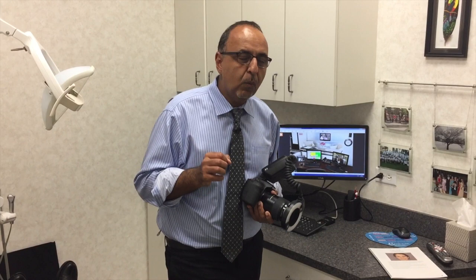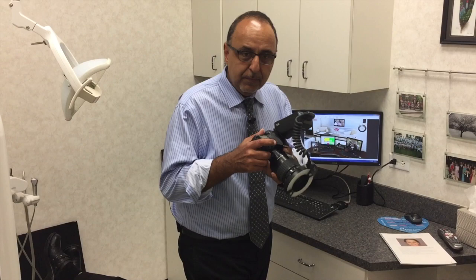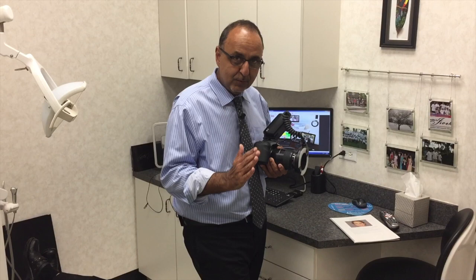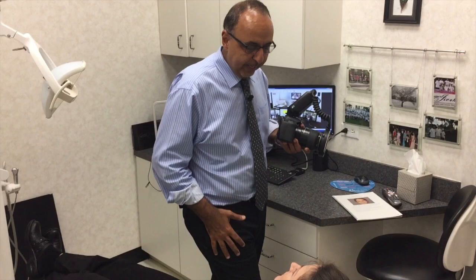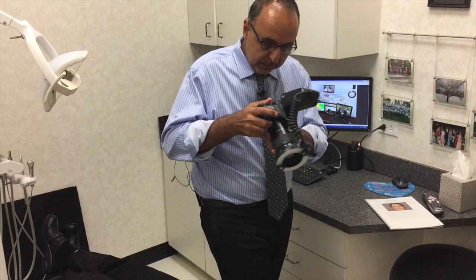I take a couple shots and pick the best one. Now it's really important for you to be comfortable — you don't want pain or to break your back taking these shots. The key is to have your leg rest on the chair so you don't put so much strain on your back. Put the chair down a little bit and get a nice angle. You can always do this hand trick — go left and right and the patient will follow you. The first shot again is lip at rest. I'll put it at the correct f-stop; this is already programmed, and every camera is different.